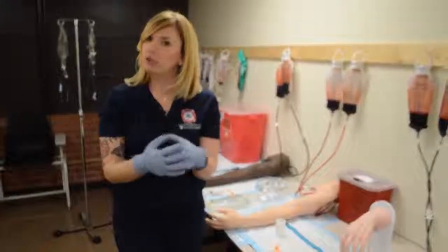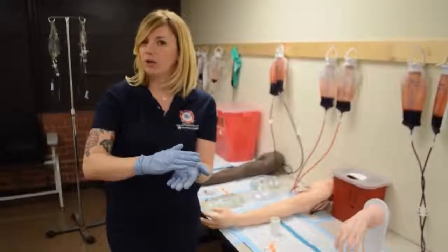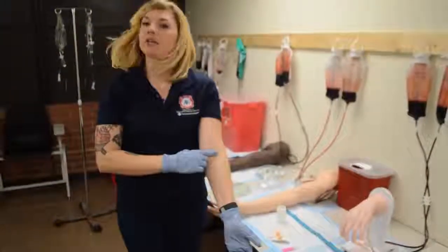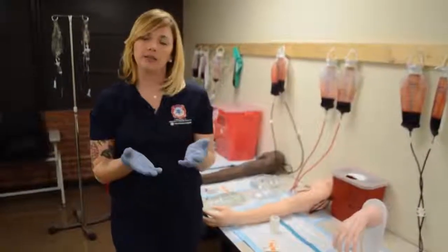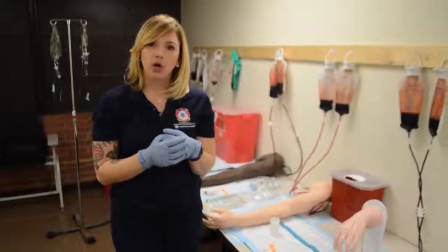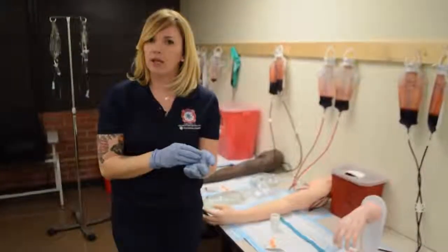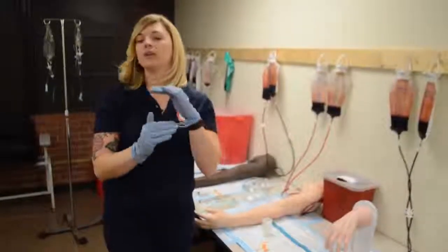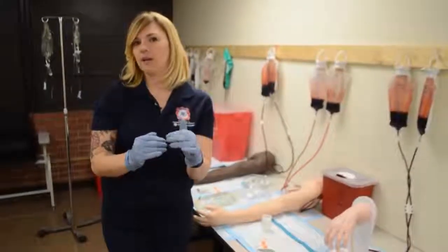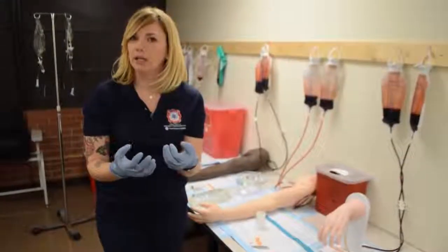The more obese your patient happens to be, the harder you need to push, because you have more tissue to pass through. So usually the vein will not be just right under the surface, but maybe a little bit deeper. But we also want to think about how thick skin is. Skin is not very thick, so we don't need to go at some crazy angle in on our needle. It's basically just to get under the skin and to poke quick, hard, and fast. Once we are in, those nerve endings are at the skin level and also surrounding the vein. So once you get into the skin, we shouldn't be causing a lot of pain to our patients. And at that time, we can readjust a little bit.